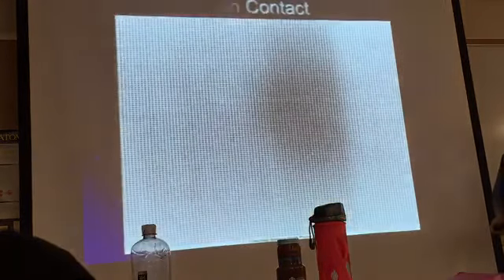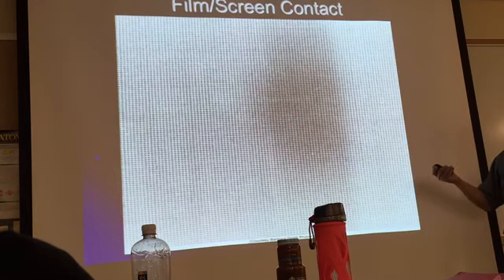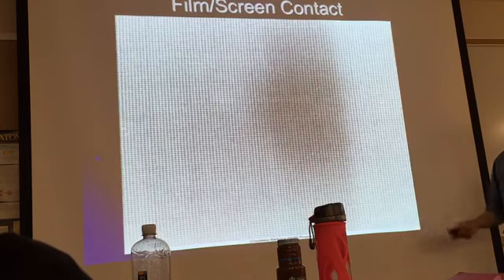But now look at this one. Something happened here. They put more weight here. Okay, this screen is ruined. You cannot keep using this screen. Maybe they had the patient stand on it, or, I don't know, okay?